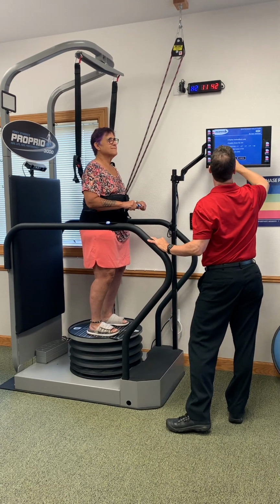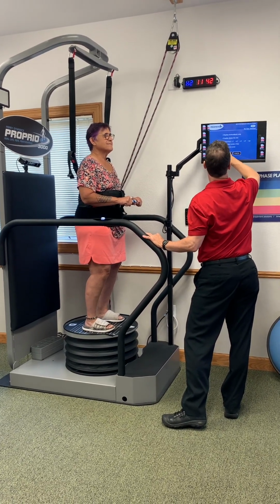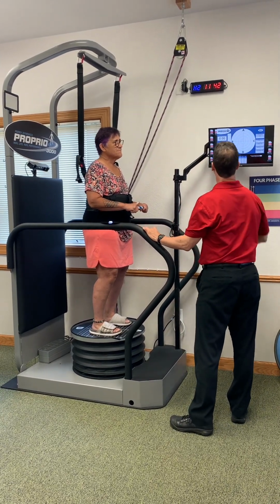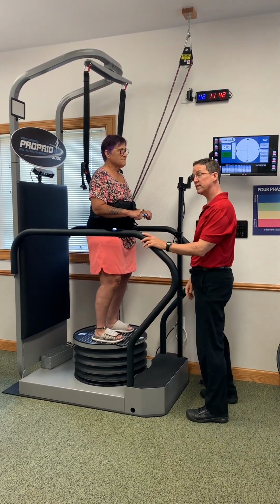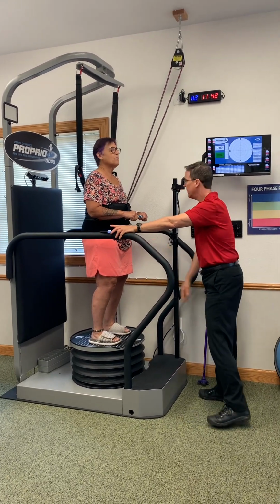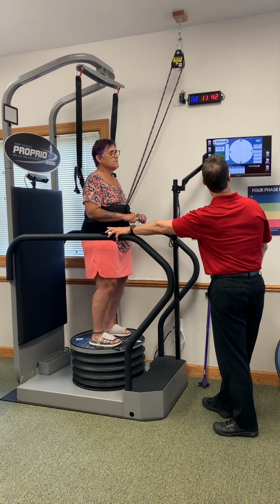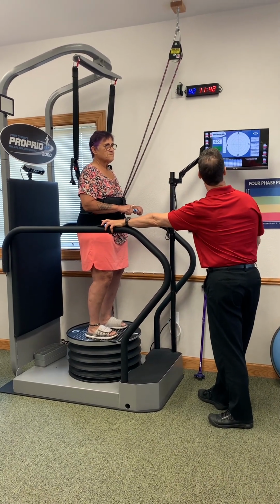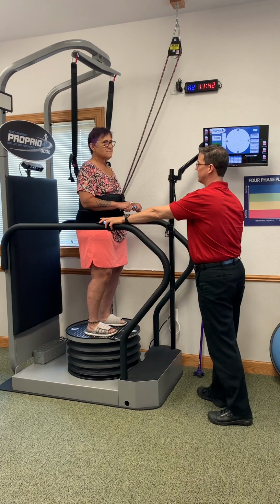Enable chase the dot. Okay, so she has control as to when it starts and stops. She can simply push this button, and I can push it as well, right? So she's always got it. What this protocol is going to do, it's going to move a little bit in all directions, at first in a random sort of way.